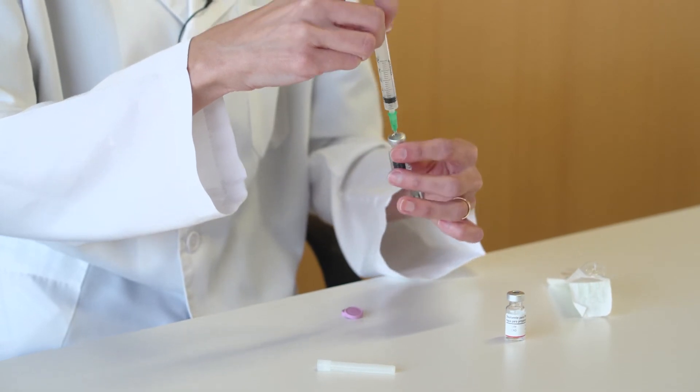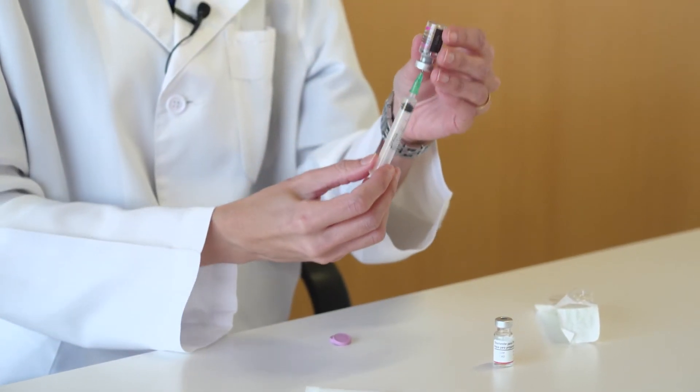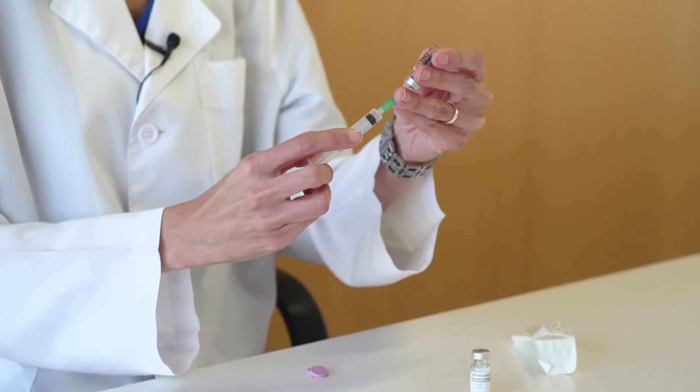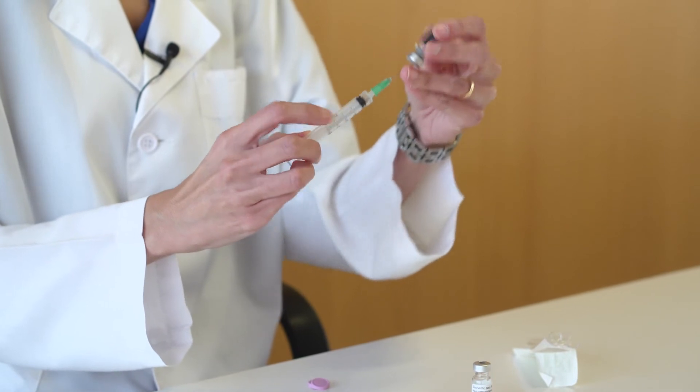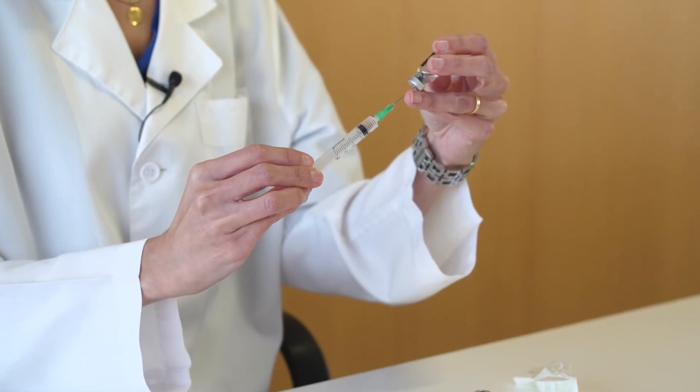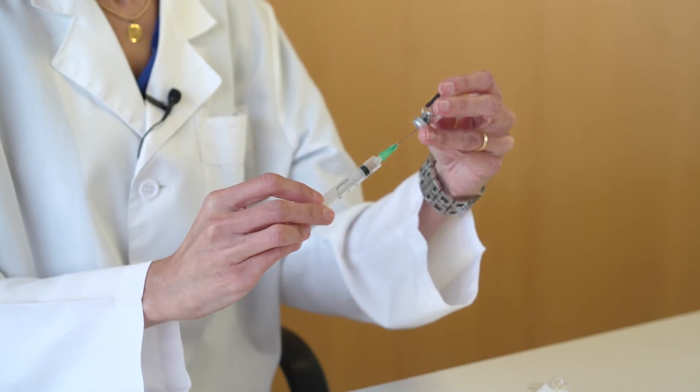With the needle still inserted, turn the vial upside down, making sure that the tip of the needle is in contact with the solution. Gently pull the plunger of the syringe to withdraw all the solution and remove the needle from the vial.